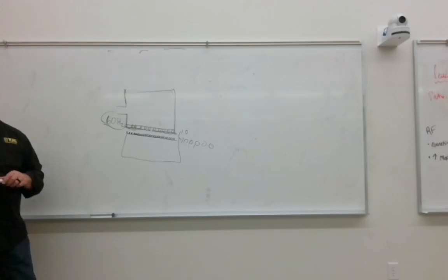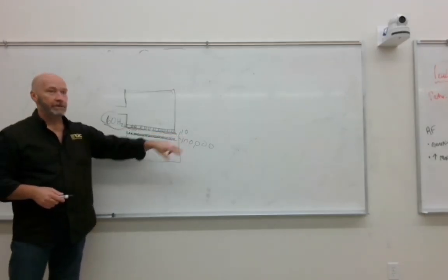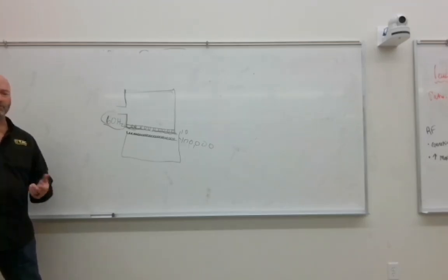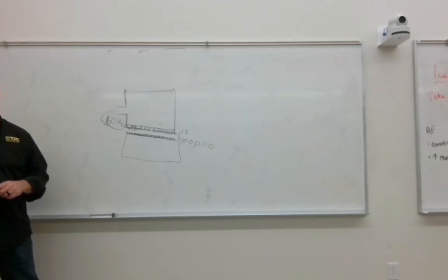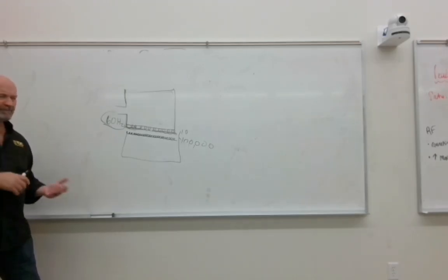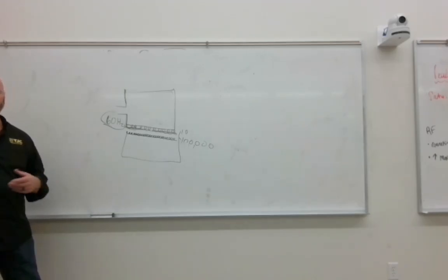And is that the same as the turns ratio? That is the turns ratio. This is the turns ratio. So in most of our current machines, our turns ratio is going to be in the thousands, 10,000s. It's going to be enormous. The filament transformer that I sent around last week, really the only thing that we're trying to accomplish is to take our voltage from, it might be 120, it might be 220, but I'm just trying to reduce it down to 25.